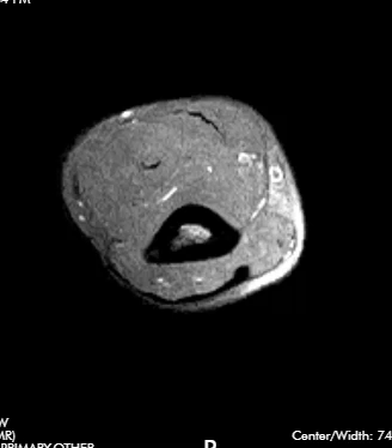Hello, this is Dr. Gay from First Look MRI and I would like to show you how to read an MRI of the elbow.